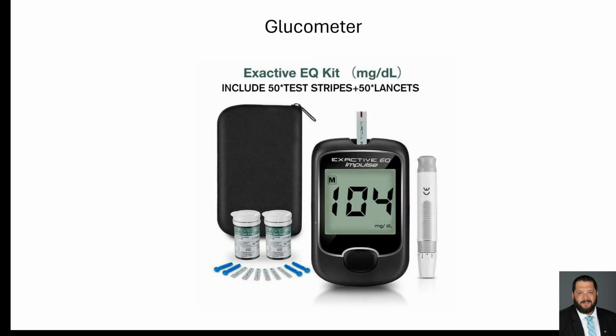clinical intervention. The glucometer. The glucometer is designed to measure the amount of glucose present in a patient's blood. This is taken at the capillary, and it's often referred to as BGL, or blood glucose level, or CBGL, capillary blood glucose level. And it's measured in milligrams per deciliter. Okay. You have a couple of devices here. You have a test strip. They typically come in containers. They're placed inside the glucometer, which usually powers on the glucometer.